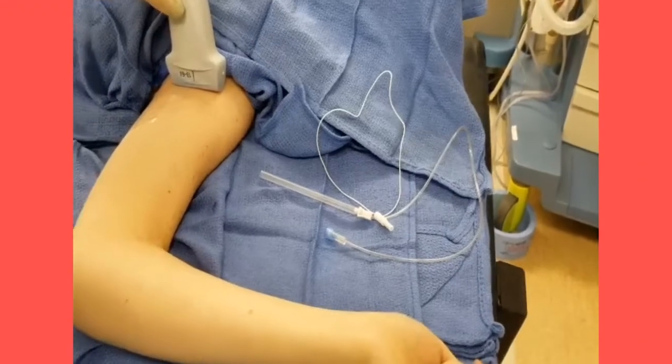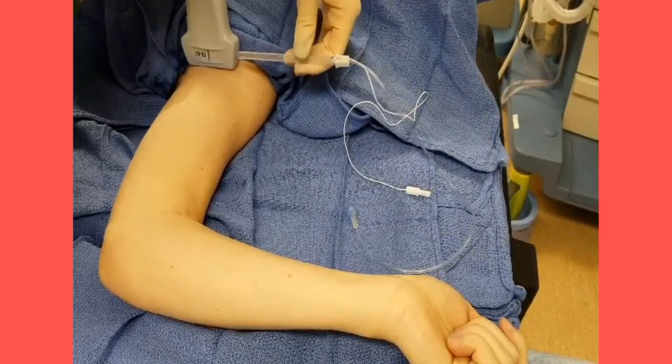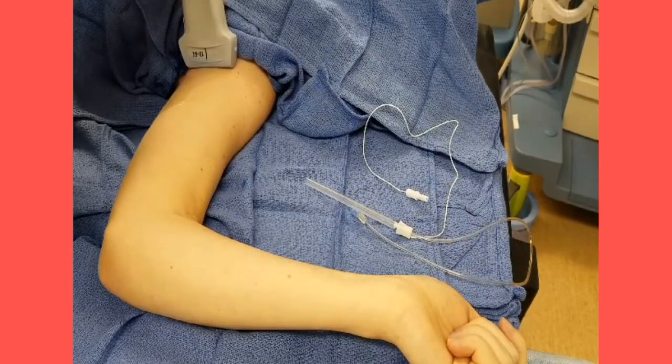For placement of an axillary block, palpate the axillary artery near the lateral edge of the pectoralis major muscle. Place the probe in the axilla and adjust distally to identify the four terminal branches around the axillary artery. Insert and redirect the needle as needed until a successful circumferential spread is achieved. Be sure to use a probe cover and sterile technique. Inject local anesthetic only after negative aspiration. If you meet resistance, stop.